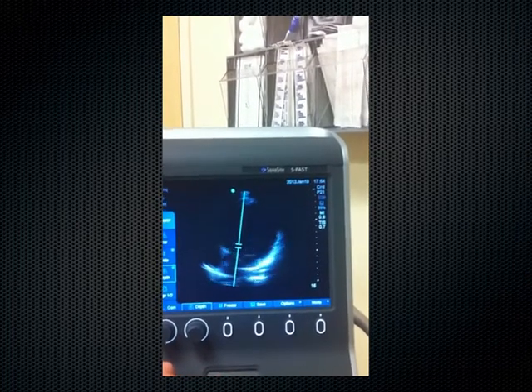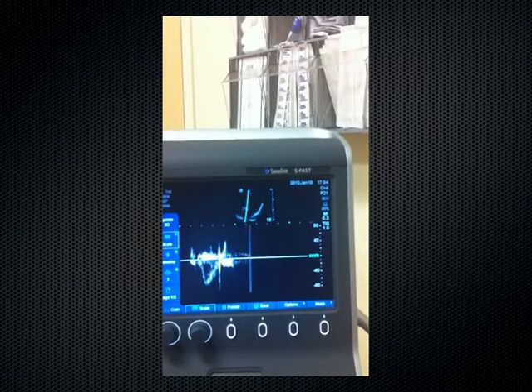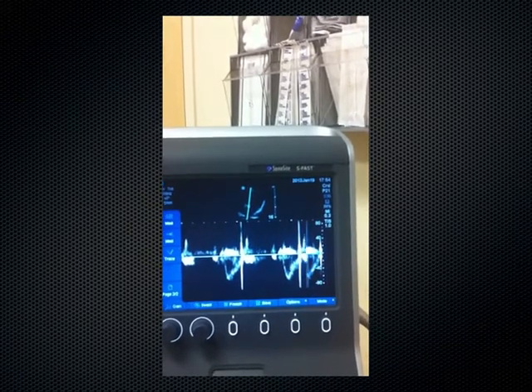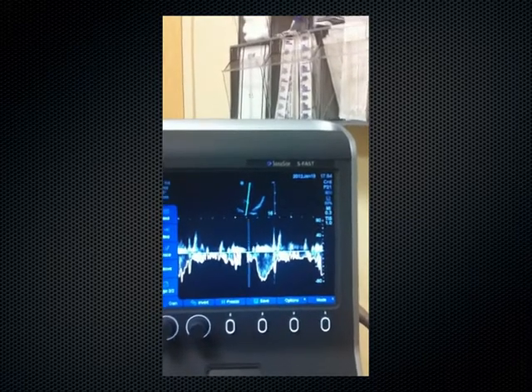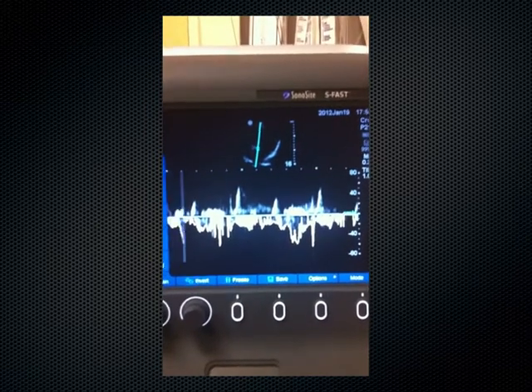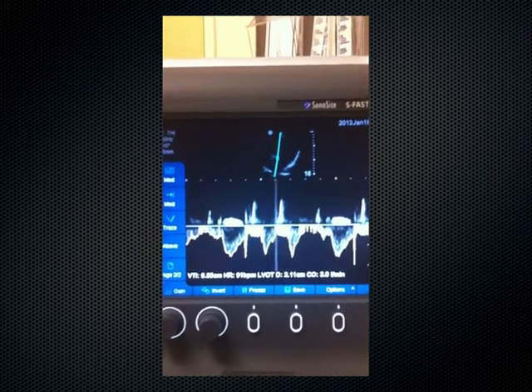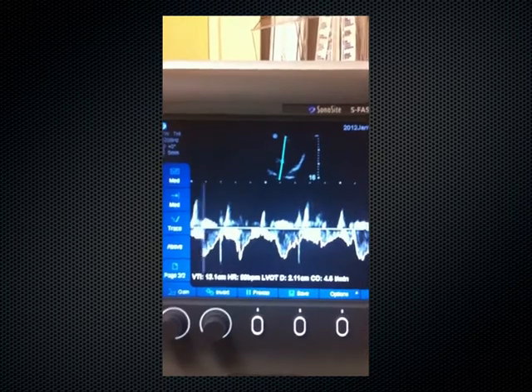It's good. Yeah. And we'll hit that again. Page 2. Trace. Let's do a retake of that. Yeah, it's basically the idea.